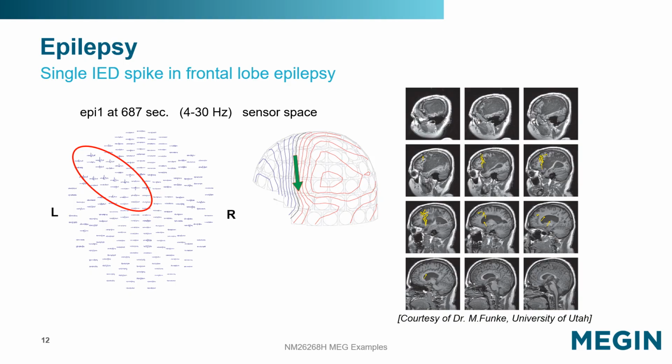It has been shown that MEG provides non-redundant information in 33% of patients and adds useful information that changes and improves treatment, thus providing clinical benefits in patients who undergo surgery. In addition, MEG and EEG in combination detect more interictal discharges compared to EEG alone.